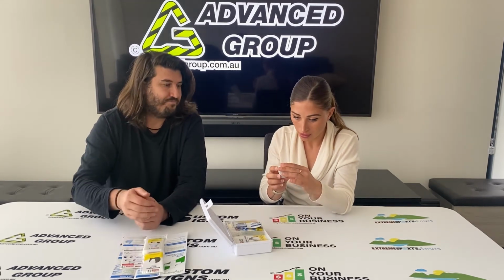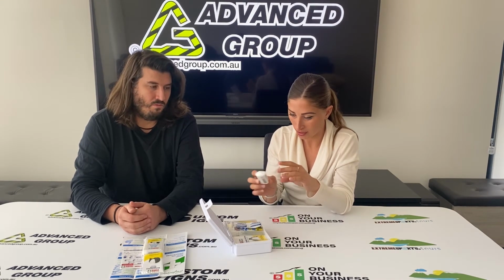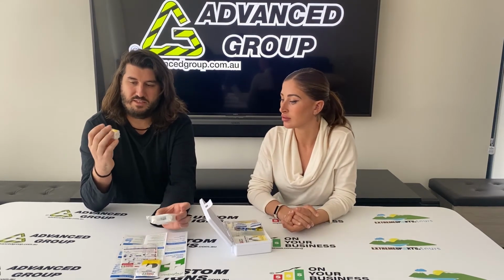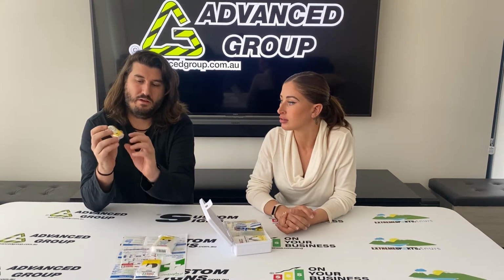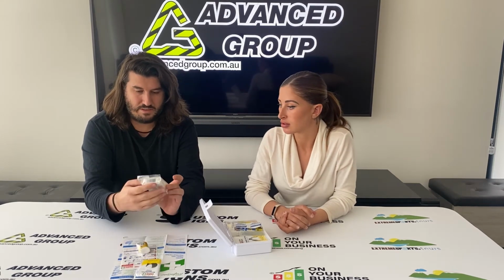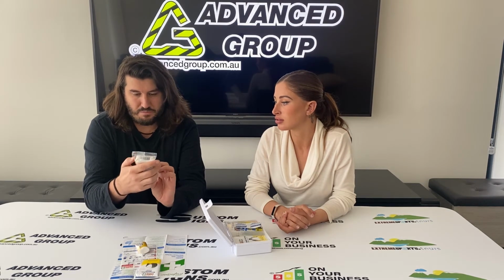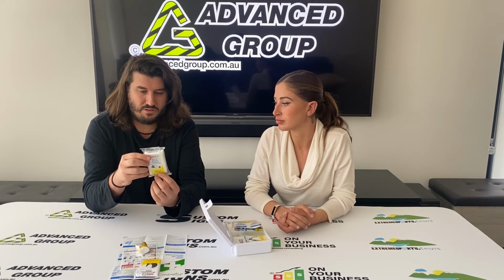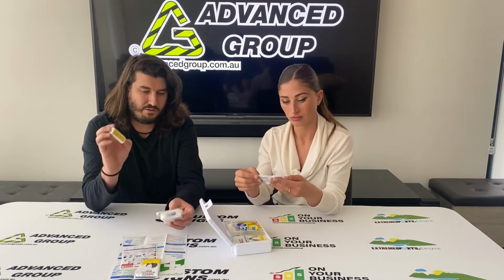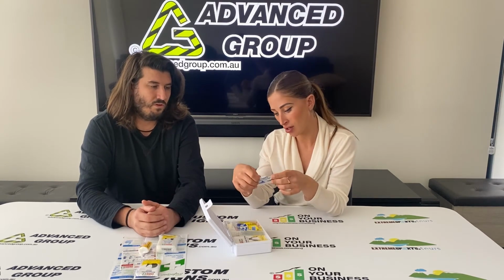Yep. And conforming bandage, so that looks like it's more for your hand area or smaller area. Yeah. So this is a larger bandage. This is a smaller bandage. They've got some dimensions on there, like say 5 centimeters. This one doesn't say at first glance how big it is, but it's got a picture of it. Yeah, so you can see, it can go around the leg. This might go around the hand.